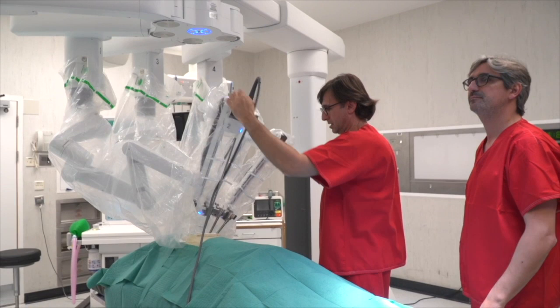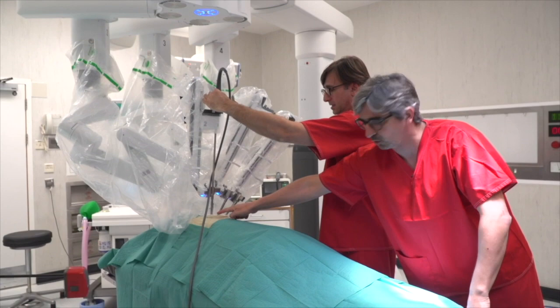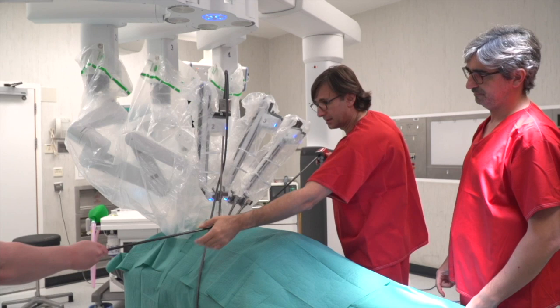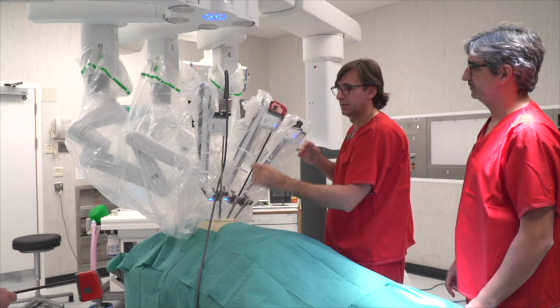Searching for the camera target. In the upper part, yes, always. This always is a very important concept. And the instruments below, parallel. Not like this. So my parallel left arm is in a prograsp, arm number three. And the right arm is the Maryland dissector.